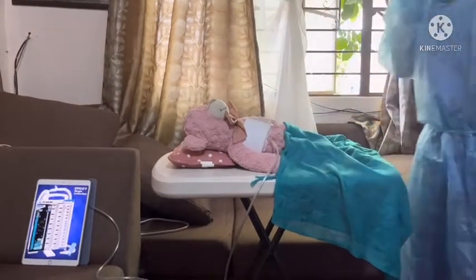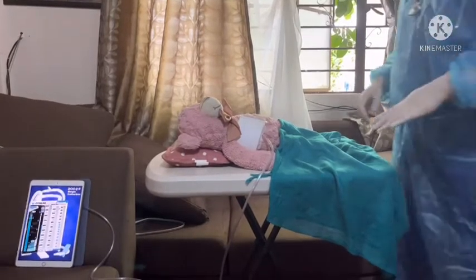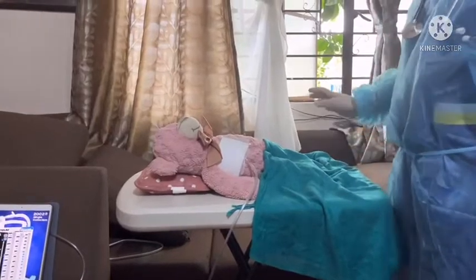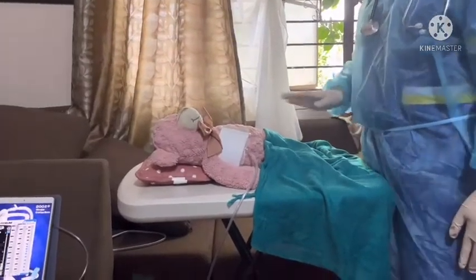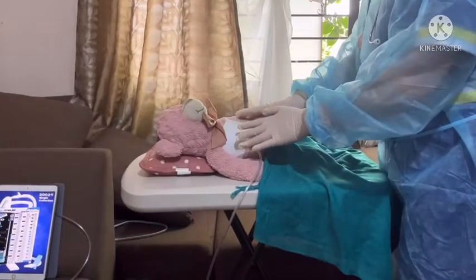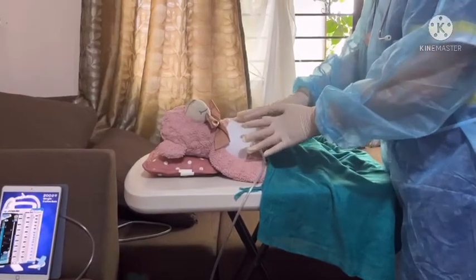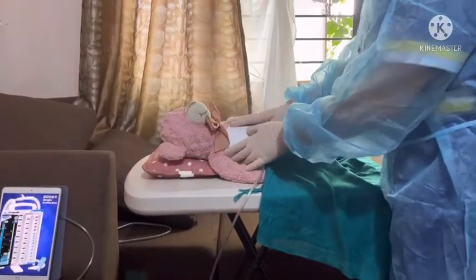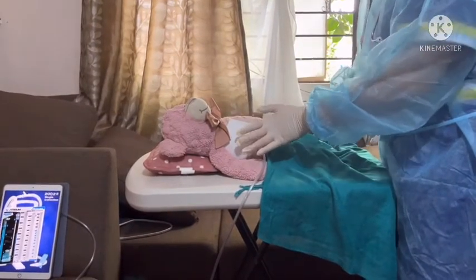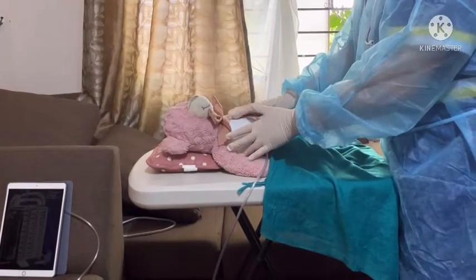After assessing the lungs, let's check the site. Make sure that the gauze is dry and intact and there is no drainage, and make sure that the tape is secure and tight to the body.